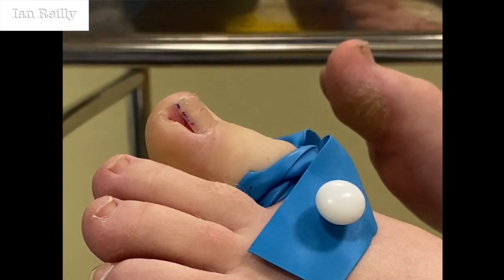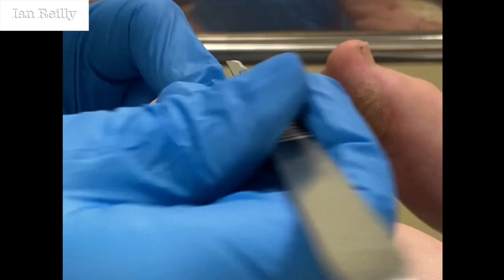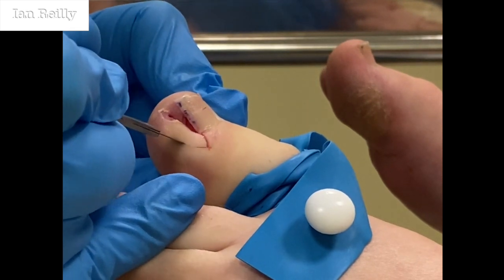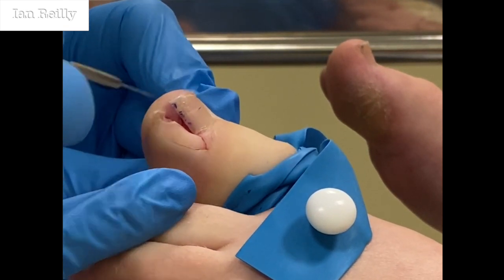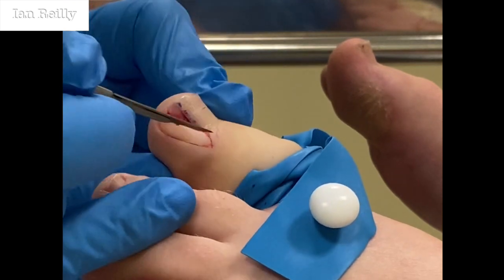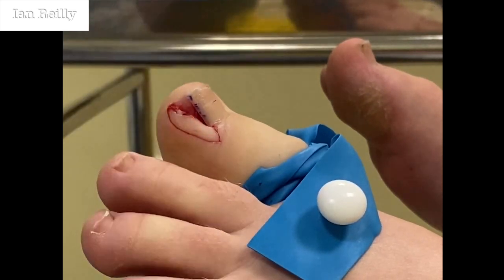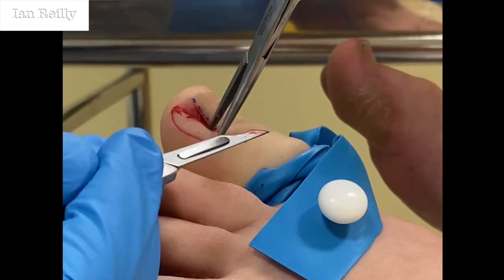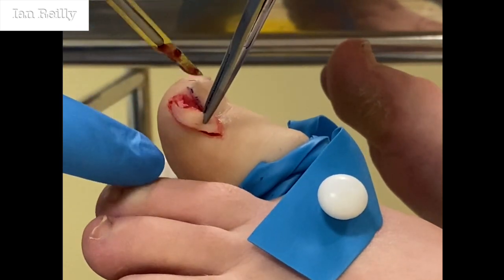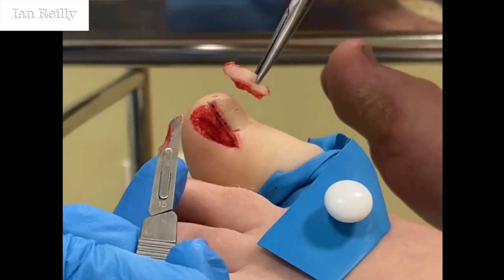And then here now is our extra tissue. So you want to come back a little bit more proximally than perhaps you would think and really take out this section. So straight through. You'll notice I'm doing a little sawing motion, which is kind of acceptable with these. So there's our section there.